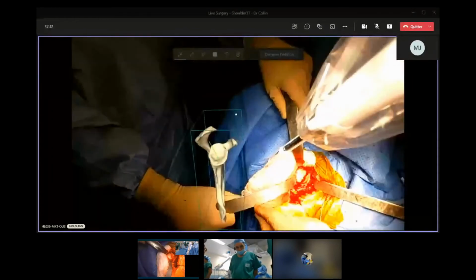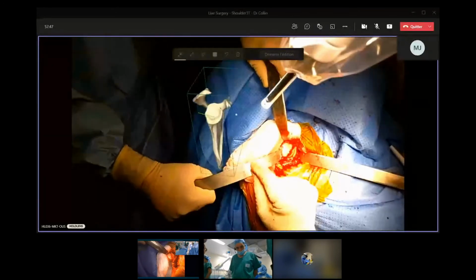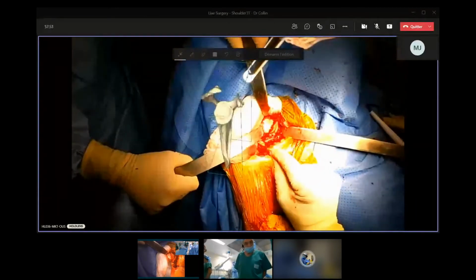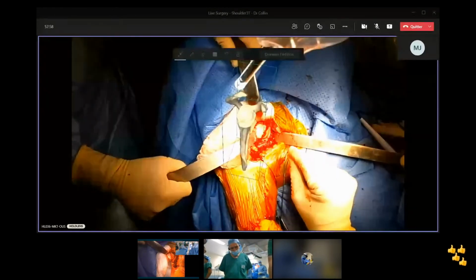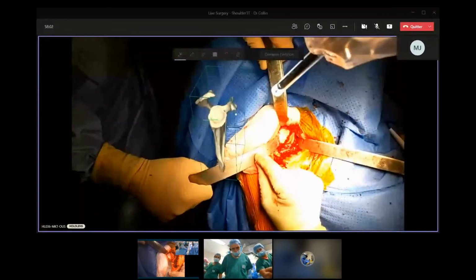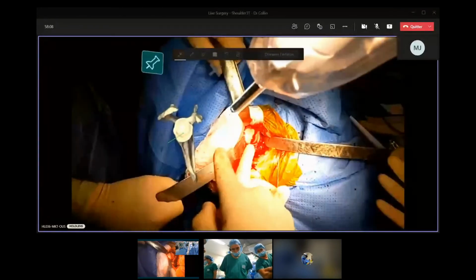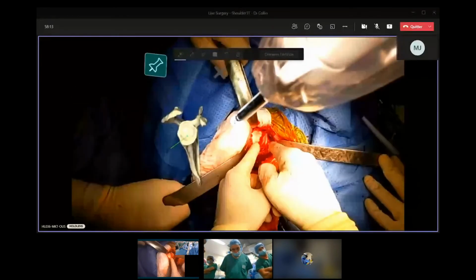And I will try to put it at the base place in order to reproduce here my entry point. Can you see? In the near future, we'll have a calibration here, but at the moment, it's not guidance, it's only visualization. So it's like this, and you can lock it here like this. So you will have always the entry point that I've prepared and the glenoid here. Okay?